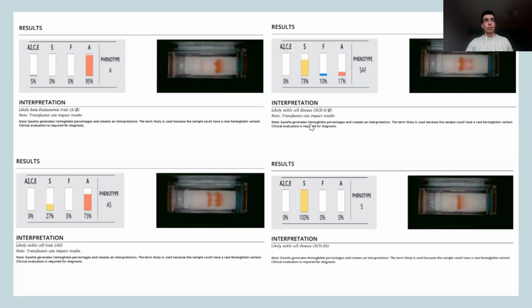I think I need to emphasize that even if this is a point of care setting, it is strongly recommended in the BSH guidelines that a secondary method is always used to confirm your first screening results. So even if this result was given as a sickle cell carrier, it could be coupled quite easily, something that could even be used in the community as well, with a sickle solubility test. Having these two together will be quite more beneficial and minimize the amount of errors.